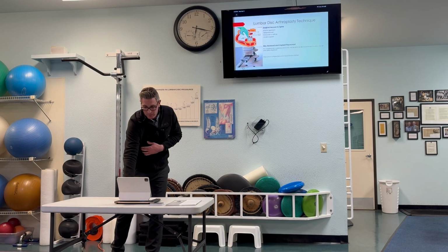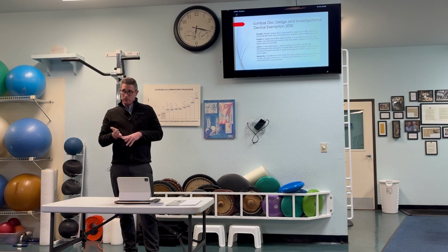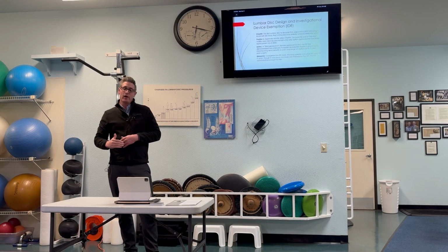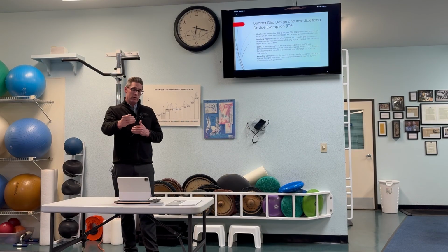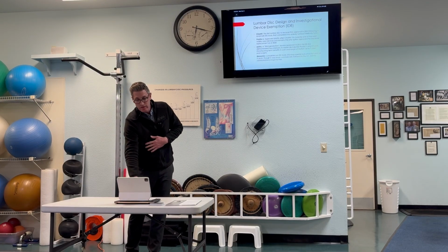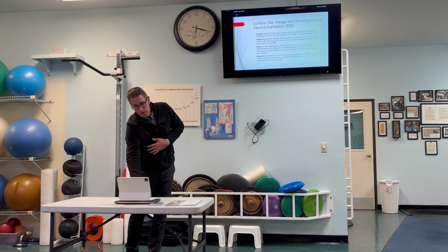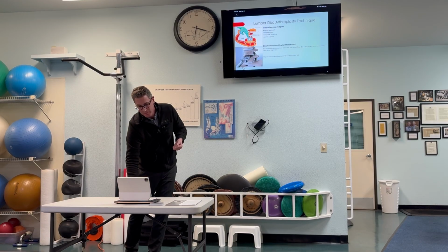To back up one, this was just some of the initial studies that were done for the investigational component of the lumbar disc arthroplasty. There were several that were on the market in the past, but as time has gone on, many of those either never actually got all the way to FDA approval or were removed. So currently there's only one disc that's approved, and this is the ProDisc L. This is by one particular company called Sentinel Spine, so it's the only disc that's on the market currently. And it's actually approved for 2 levels, whereas before it was only approved for 1 level of lumbar disc replacement.